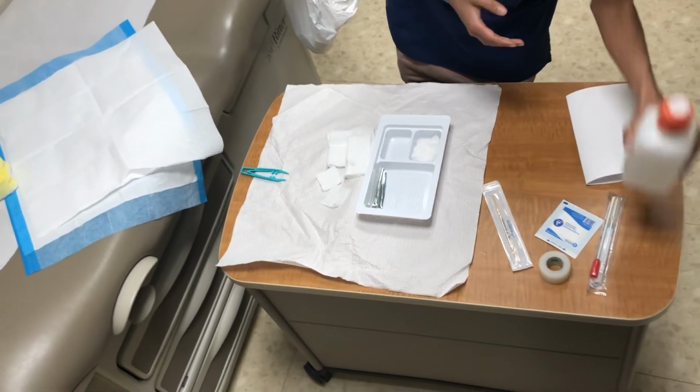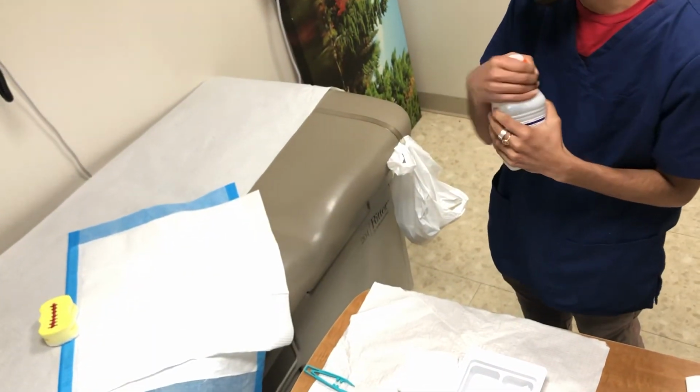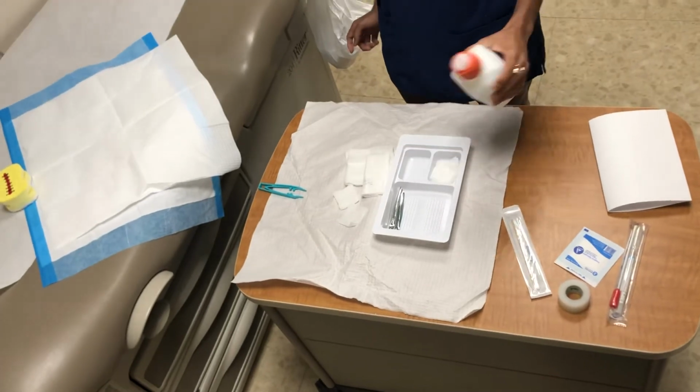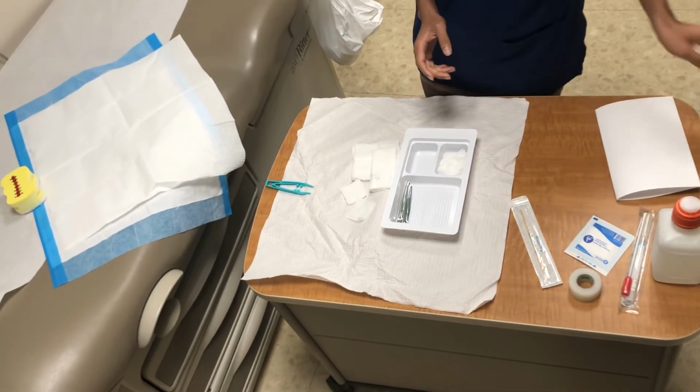And I'm gonna take my saline, look at the expiration date, put my hand over the label, open it. I'm gonna pour some out, and then I'm gonna pour some in the sterile container. I'm gonna cap this and put it back down.